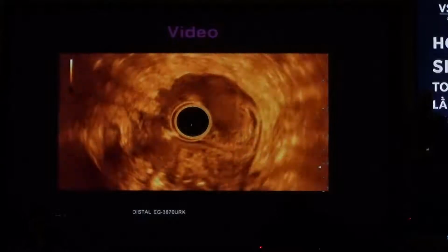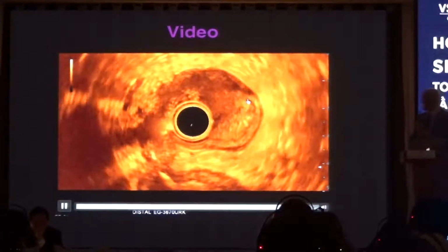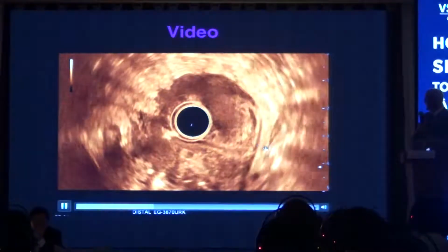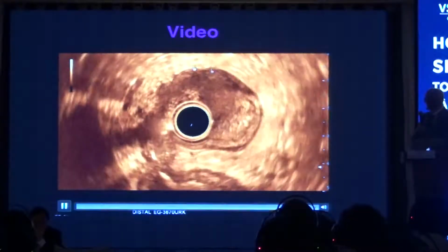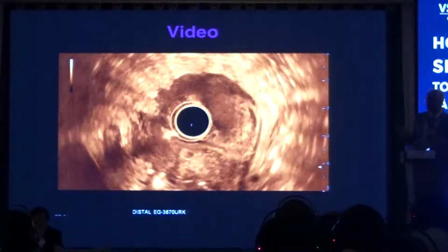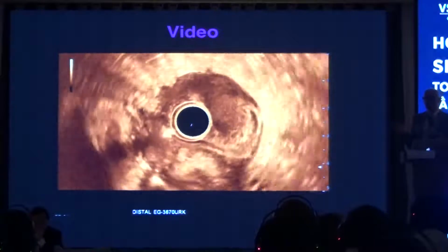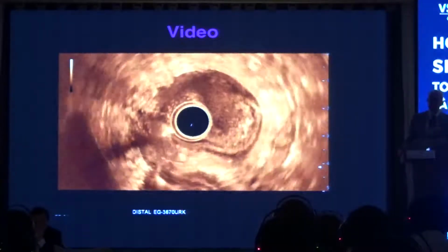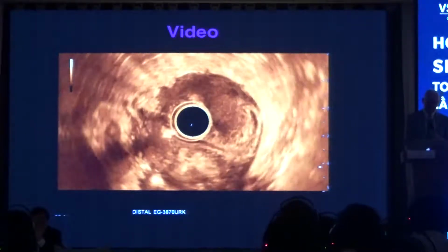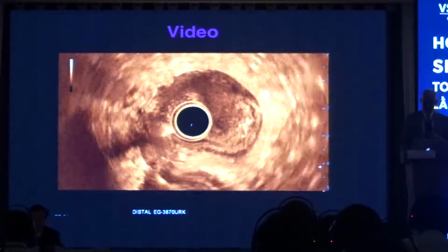That means if a lesion is growing and infiltrating below the intestinal wall. Here you can see nicely an image of a stomach cancer, and you can see movements right on here, and you can see infiltration and no movements over there. So real-time imaging observation might give you an additional clue, not proof, that it was finally a T3 lesion, and we are observing the borders a little better.